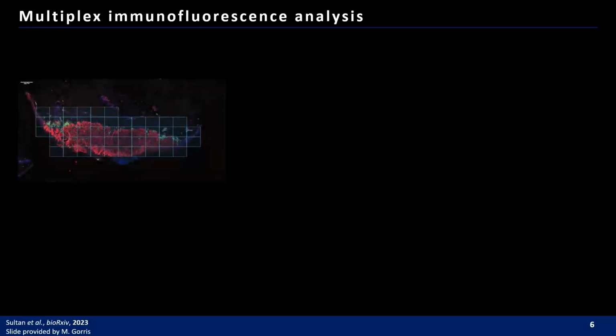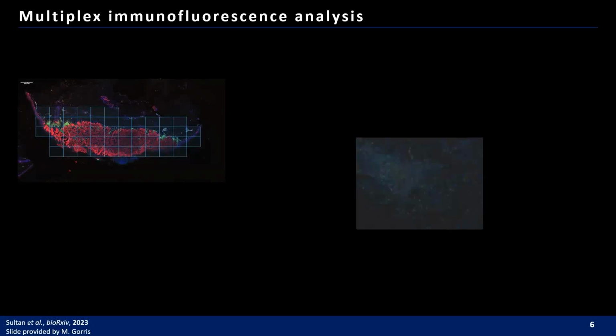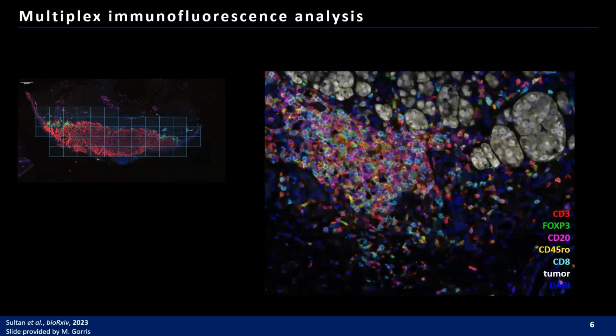The following image was generated using the Vectra Polaris multispectral maps. The tumor tissue was scanned entirely, including the invasive zones and surroundings shown. The image was unmixed using the INFORM software to visualize markers representative of a lymphocyte staining panel. We can trace back cytotoxic T cells, regulatory T cells, helper T cells, memory T cells, and B cells based on their cell surface expression markers.